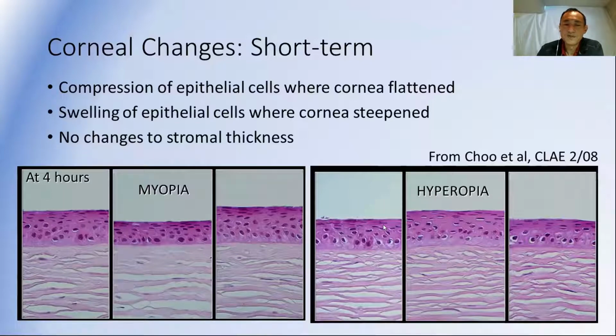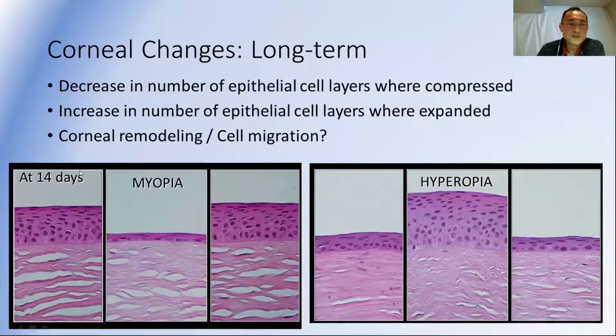So short-term, we see that we do have significant changes in the thickness of the epithelium, and so even after one night of wear, you'll have a significant change in the corneal topography and significant change in the patient's vision. And we see that on all of our patients.